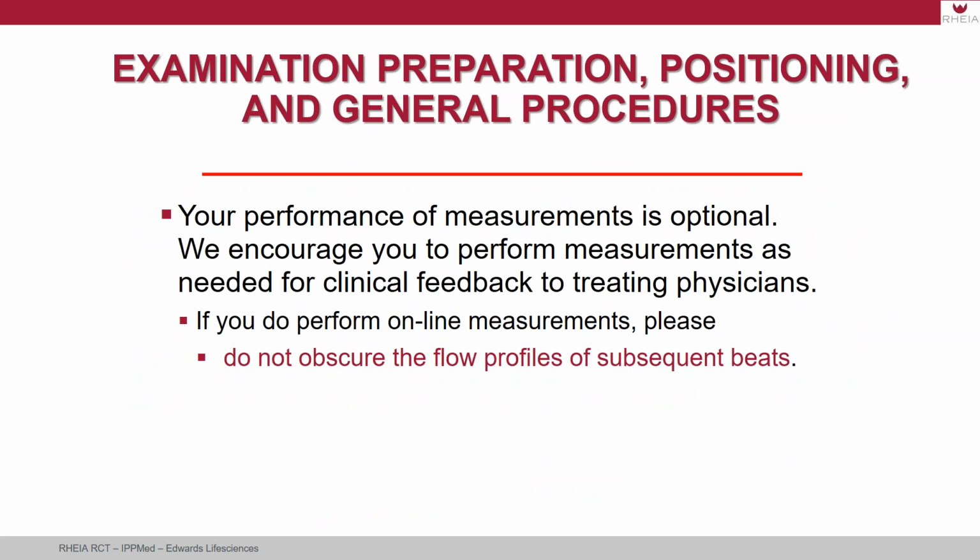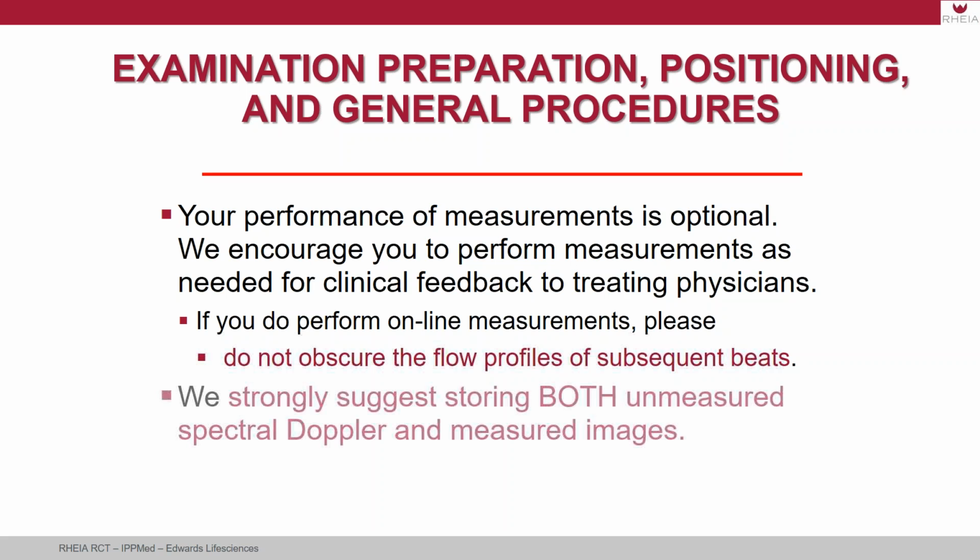So you can do the measurements and the tracing. We understand that for the clinical follow-up of the patient, you may need to do these measurements, and you can leave the measurements on the images and the exam that you send to us. But please make sure that your measurements do not obscure the other beats or the flow profiles, and make sure to leave us several beats or images that are untraced. We will redo all the measurements.